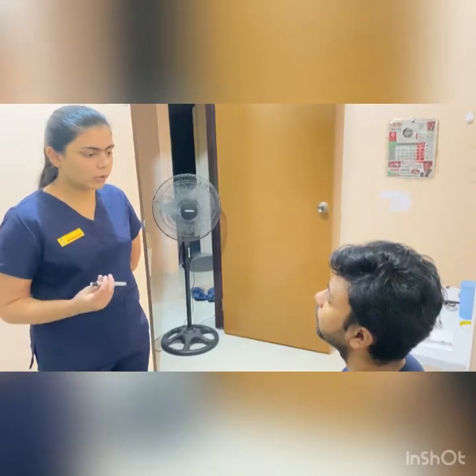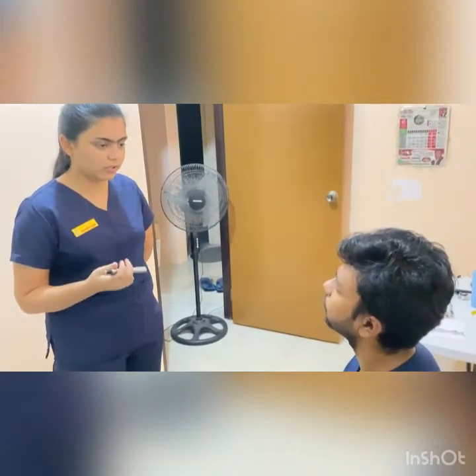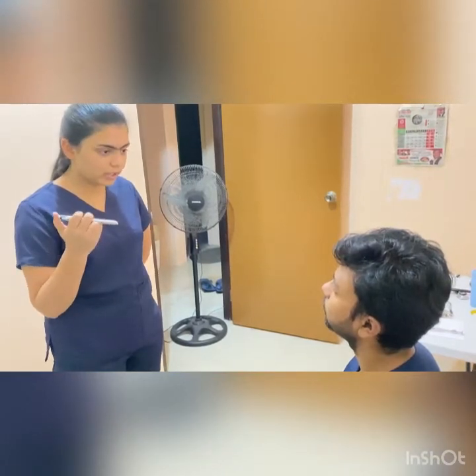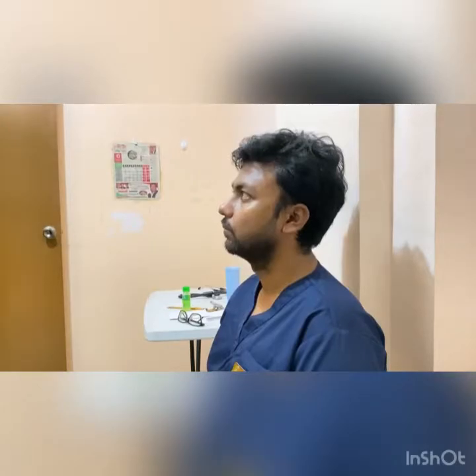Sir, now I am going to perform the light reaction to test your pupillary reactions. For that, I'll be shining this light in your eyes. Is that okay? Okay. Make sure that the room is dark. First we'll be checking for direct reaction. Look away. For this, we'll see the direct reaction of the pupils, which is visible over here. The pupils are constricting on light exposure.